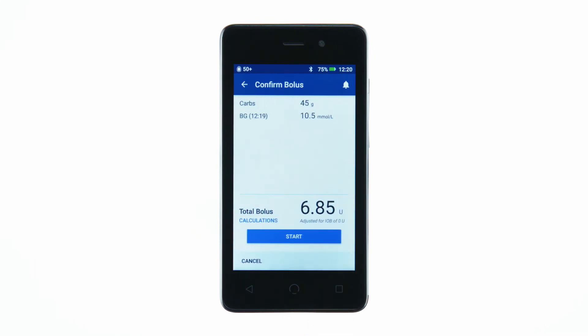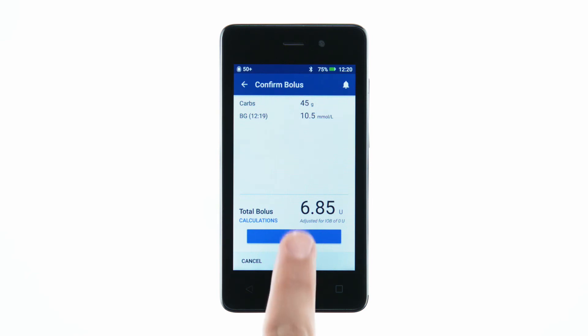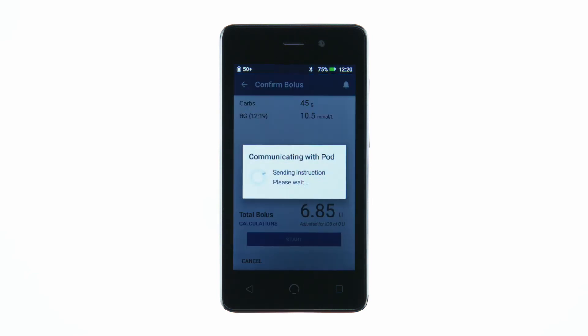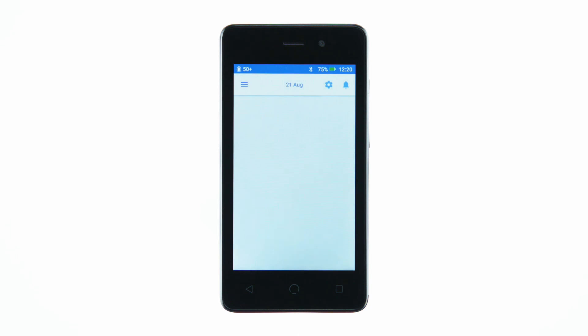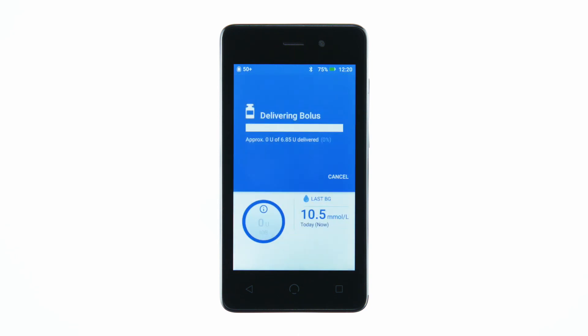Review the bolus details on the Confirm bolus screen. Then tap Start to begin the bolus. While the bolus is delivering, you will see a progress bar.